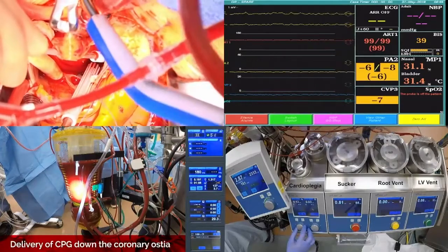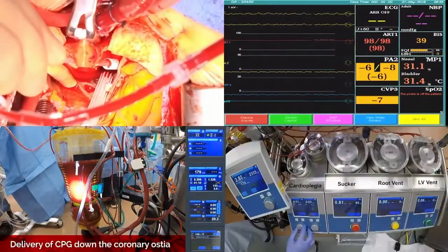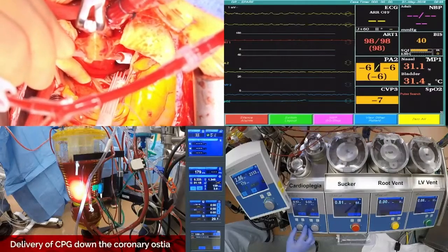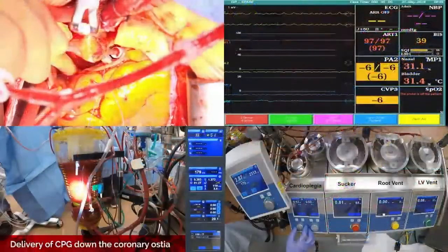Now, Del Nido is something I'm interested in as far as something like this. Yeah, we did a session on Del Nido cardioplegia for my minimally invasive stuff. So we'll talk about that. But you don't need it for the mitrals. For the aortics you do, yes. That's the hyperkalemia technique. So why don't we move right on up to 56 minutes and 35 seconds?